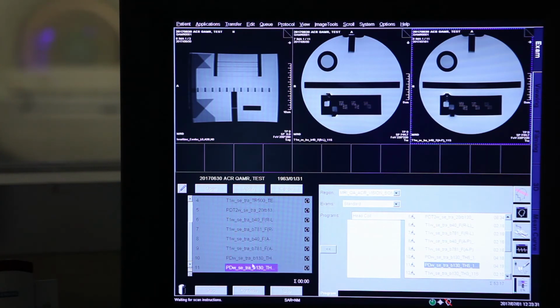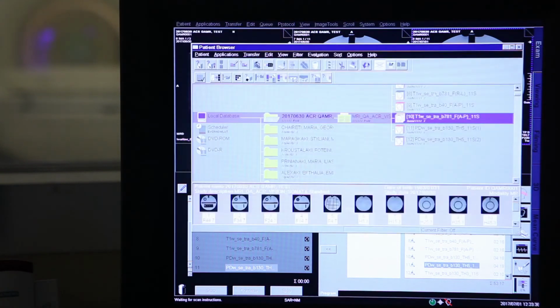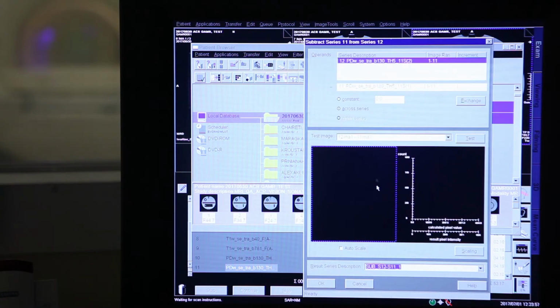So practically now we have to subtract those two series, exactly the way we did with the variable bandwidths, right? So what do you expect to see? That's a good question. You expect to see the difference between two signals. So at the end, you're going to see something which looks like the subtraction. I'm going to show it now.